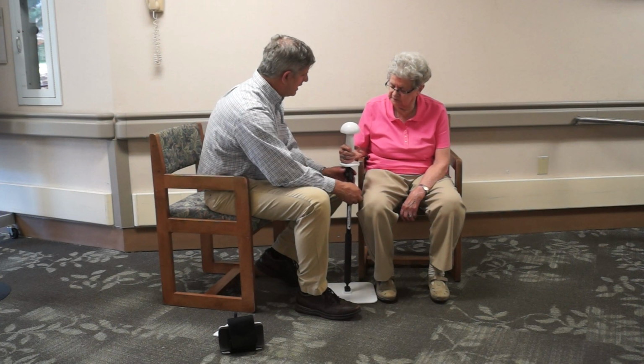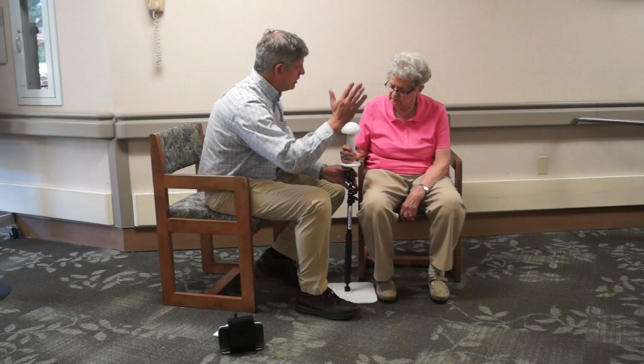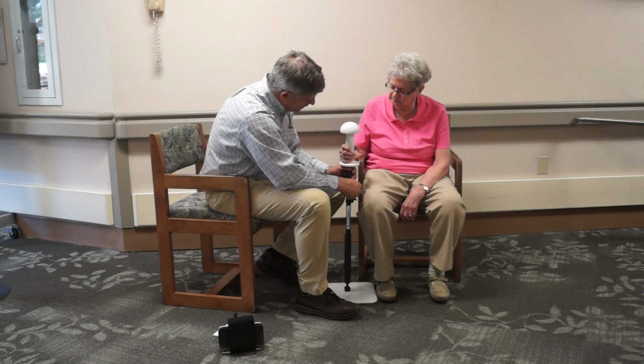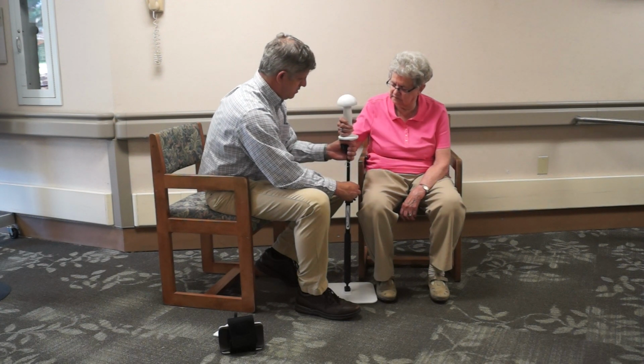So I'm going to bring it up a little higher so as you're reaching, you're going up a little bit. All right. So let me bring you up a little higher. Just keep your hand on there.